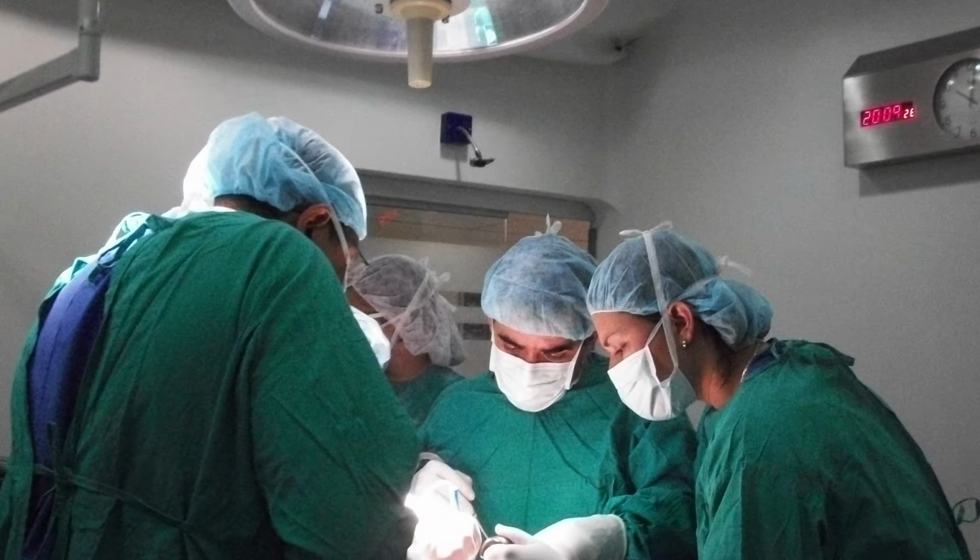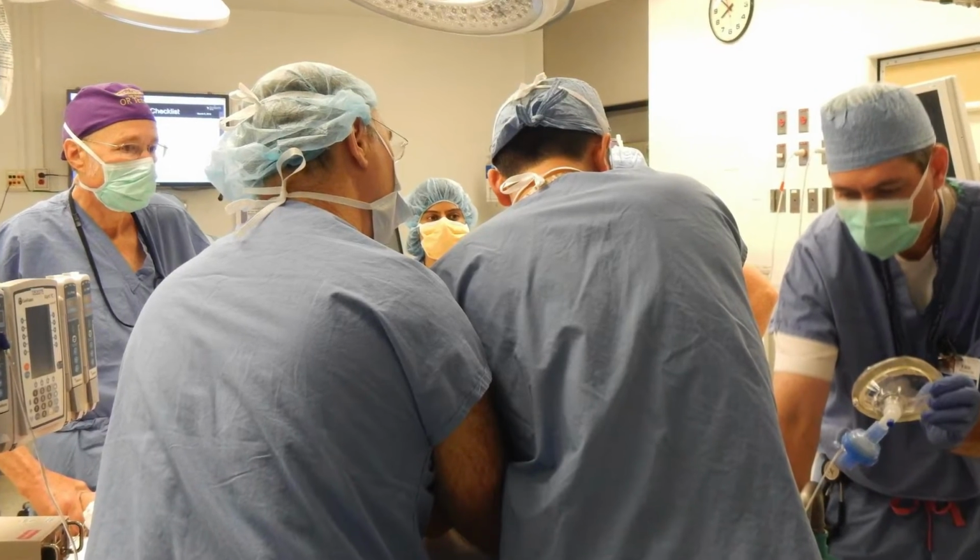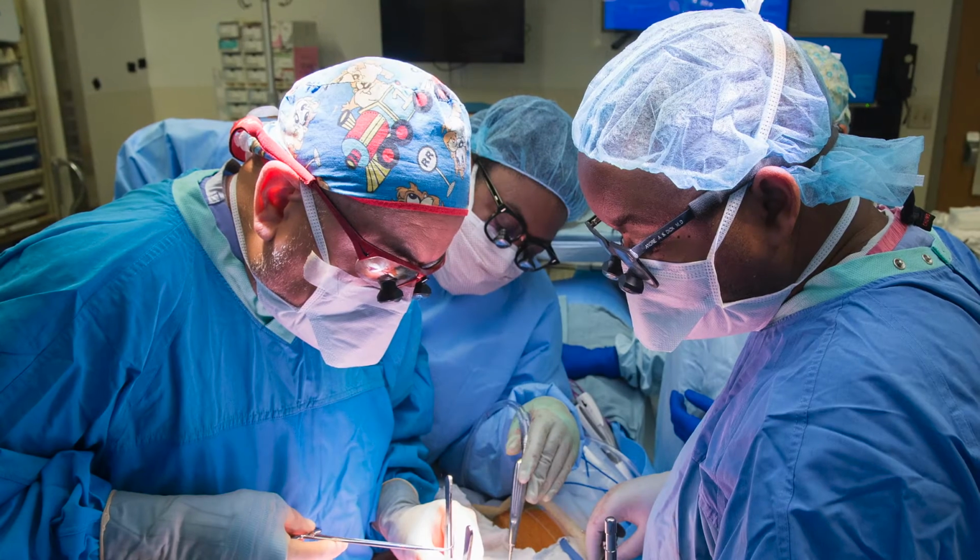We just kind of had a brainstorming session sitting around my table, and he came up with this idea. He said he was often having to treat abscesses. Dr. Chan and his UW colleagues employ surgery and catheter drainage to treat abscesses on a daily basis. And so we thought that was a really interesting application for HIFU, because mostly HIFU is being used to disintegrate tissues or to destroy cancer cells in tumors. It just naturally came to us of saying, wait a second, we oftentimes see these abscesses and treat them by using ultrasound to place a drain. What if we turn up the energy of the ultrasound so much so that we could destroy the bacteria within the abscess just like we were destroying cancer cells within a tumor?